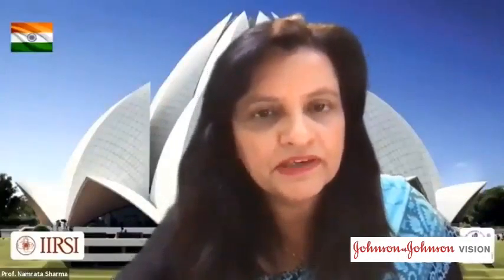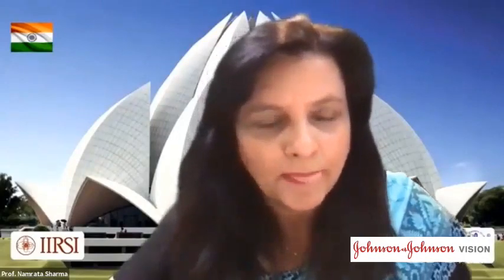Well, with regards to pseudo-exfoliation, there should not be any problem dealing with the pupil, because the pupil is going to be working okay. On the contrary, it will be a little smaller than normal at the end. And what was the second situation you said? The second was when you have a trauma and the iris kind of gets depigmented, becomes friable, then becomes difficult to handle also.